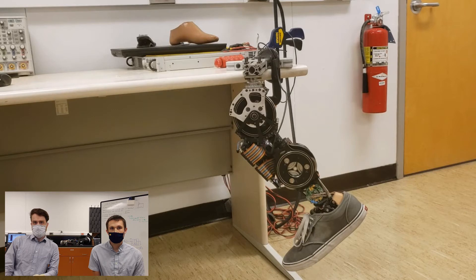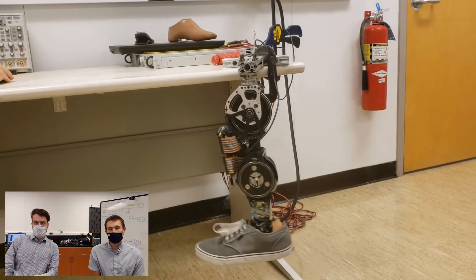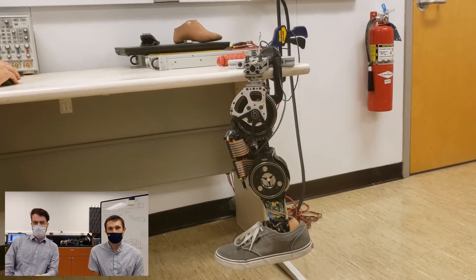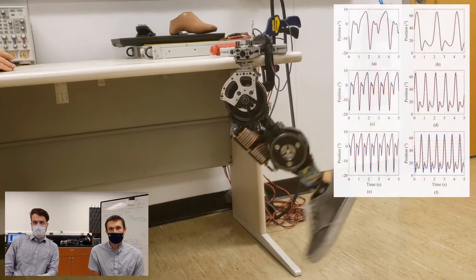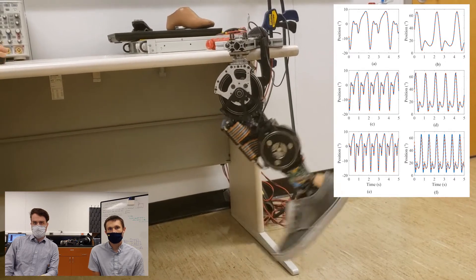While this leg is capable of accurate impedance control, its high-torque motors also work well for position control paradigms. In this example, Kevin will command the leg to track a sine wave at a frequency similar to what would be required for fast walking. Since there are no elastic elements in the drivetrain, the position can be accurately tracked. As these plots show, the leg is capable of tracking human gait trajectories at a variety of speeds with high accuracy.